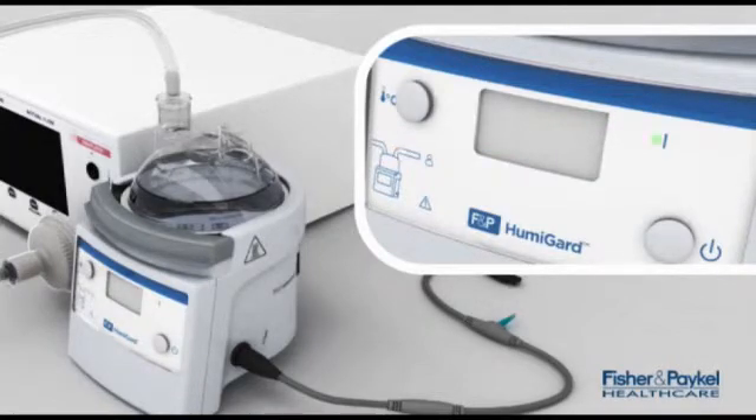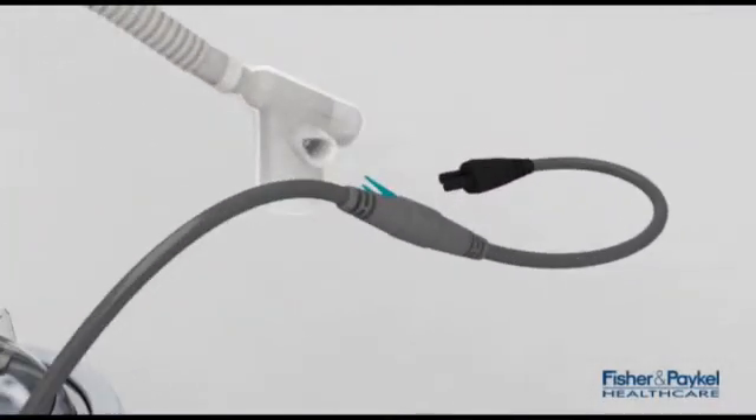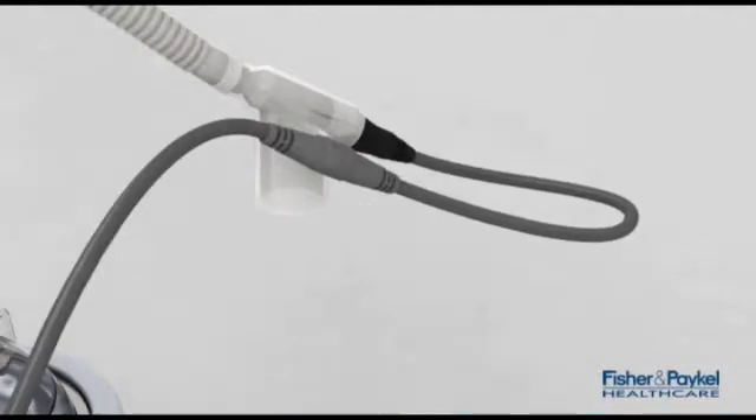When it is time to connect the heated insufflation tube, take the electrical adapter and push the blue temperature and flow probe into the side port of the elbow and insert the black plug.